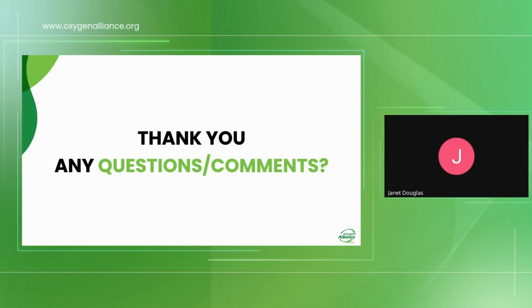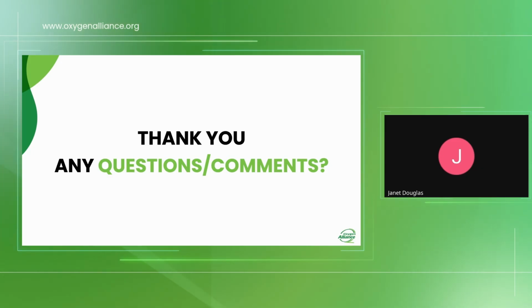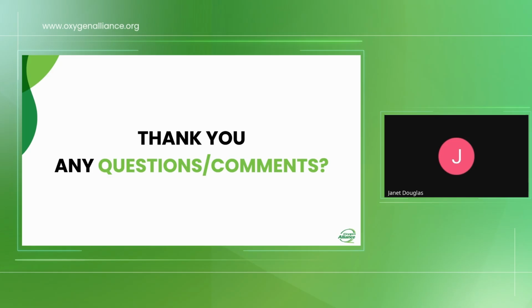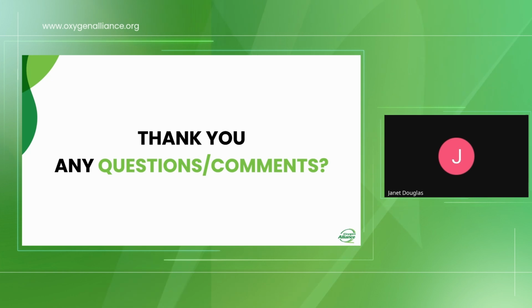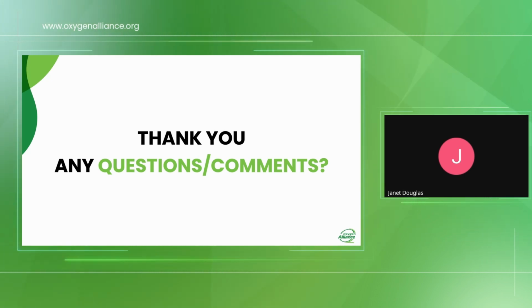But calibrations normally not just anyone can do. As long as you know how to calibrate, you can go along. Otherwise, they also recommend that you contact the manufacturer, because you need the passwords into the service system of the patient monitor. If you have access to the password, it allows you to do the calibration.